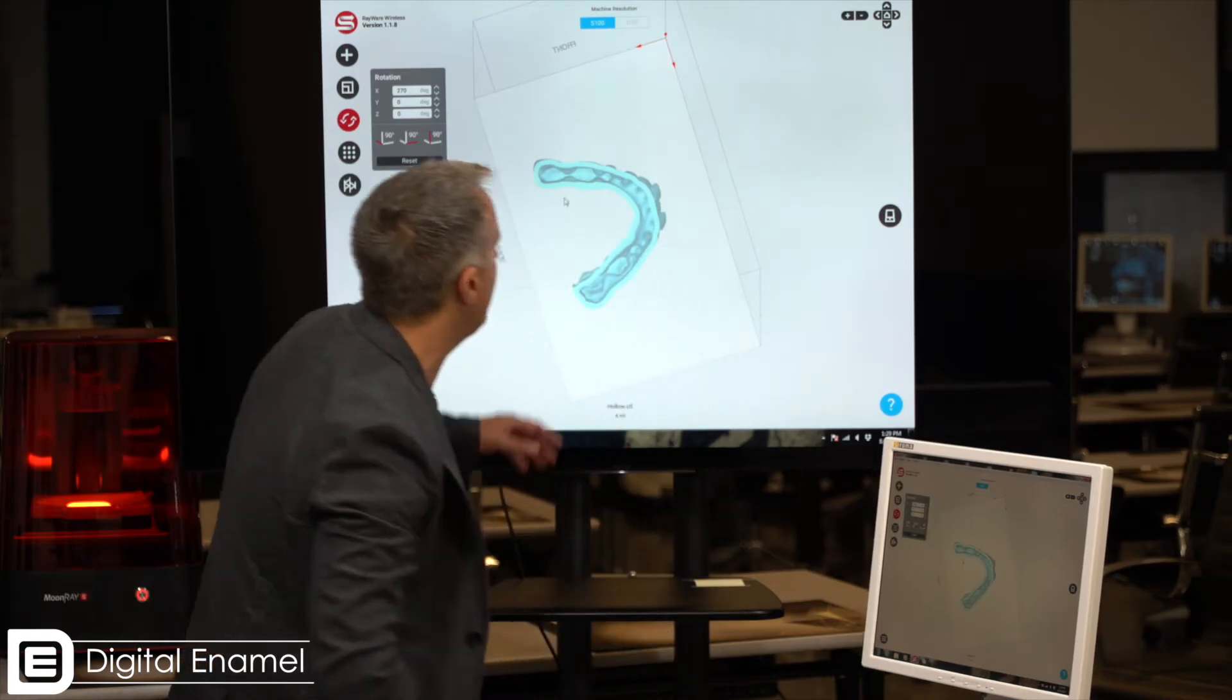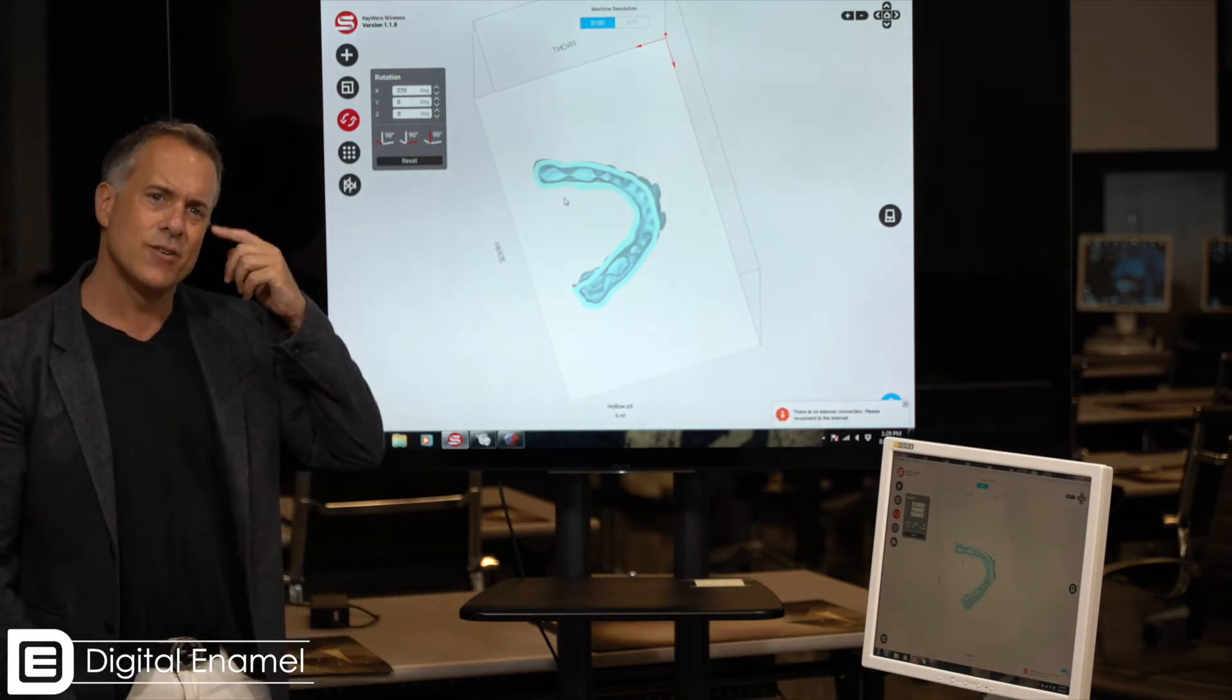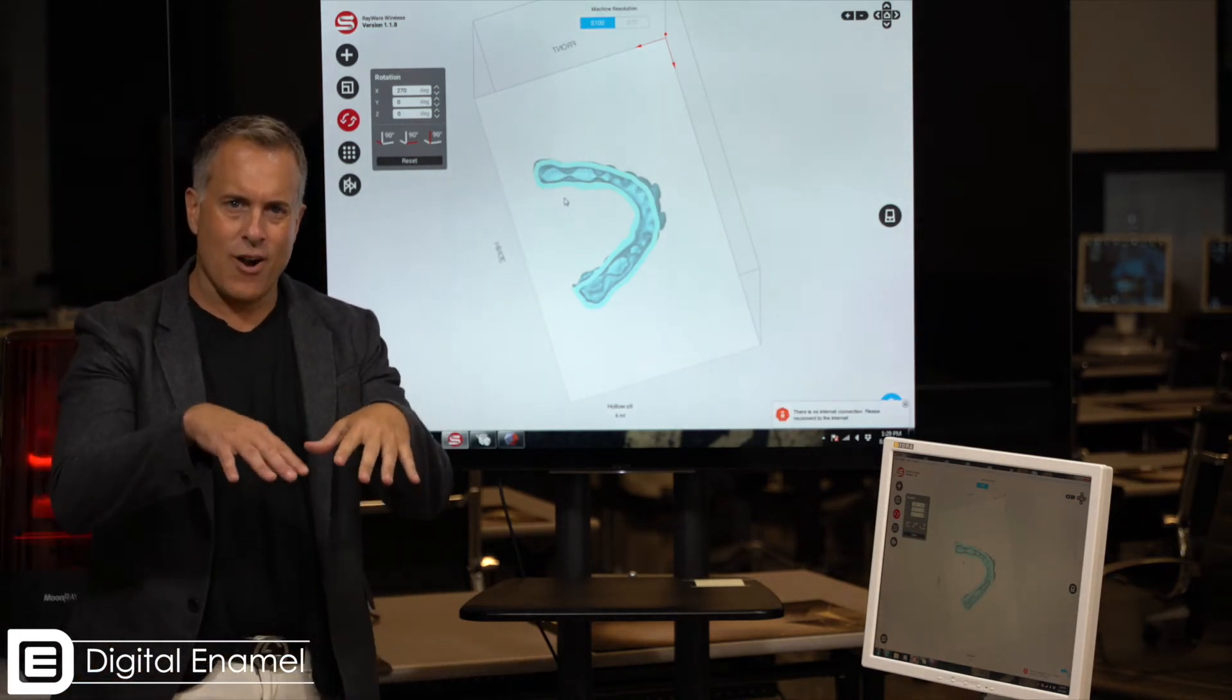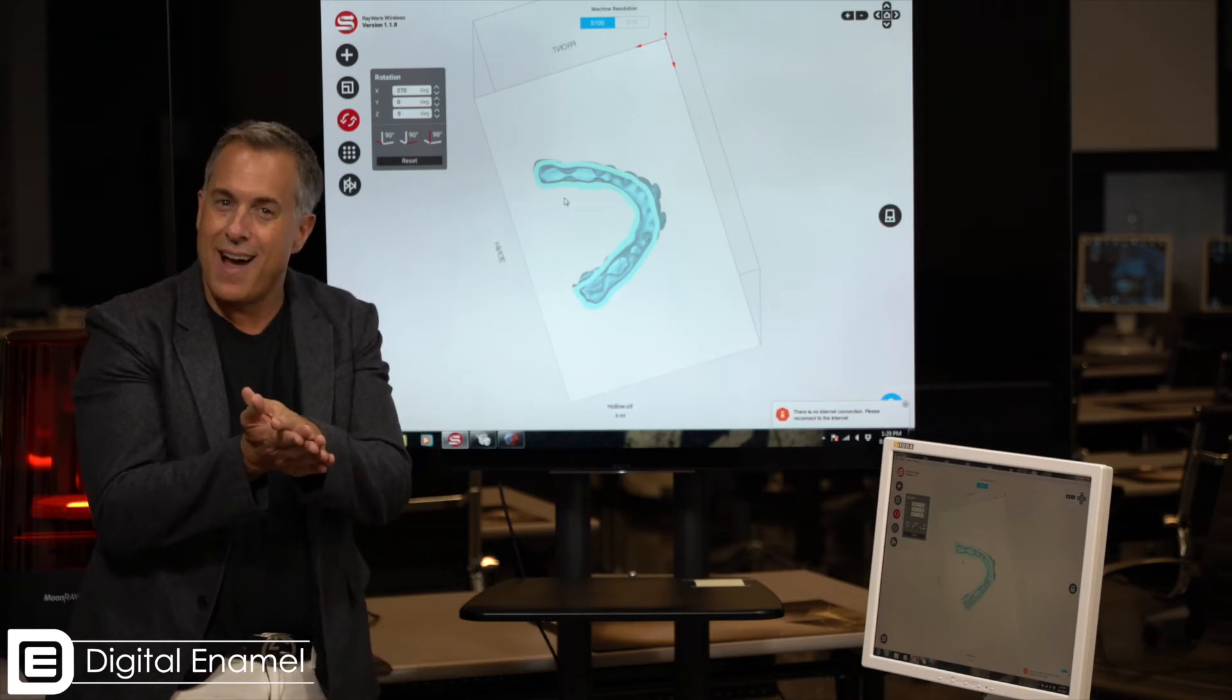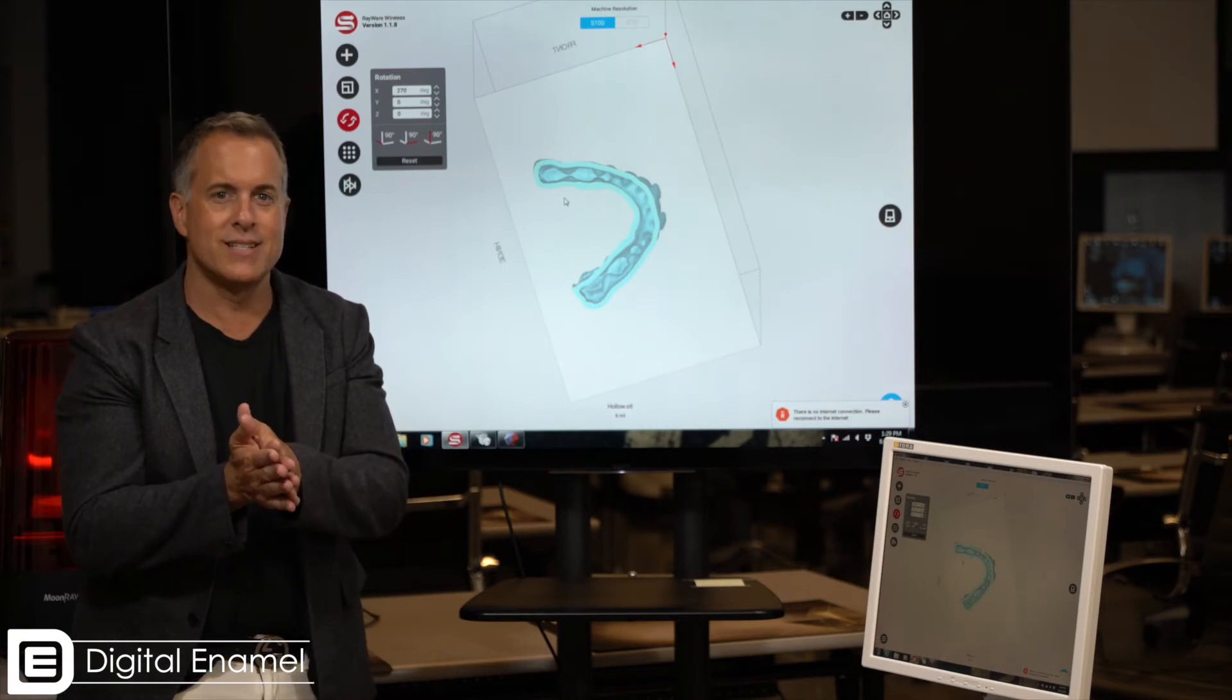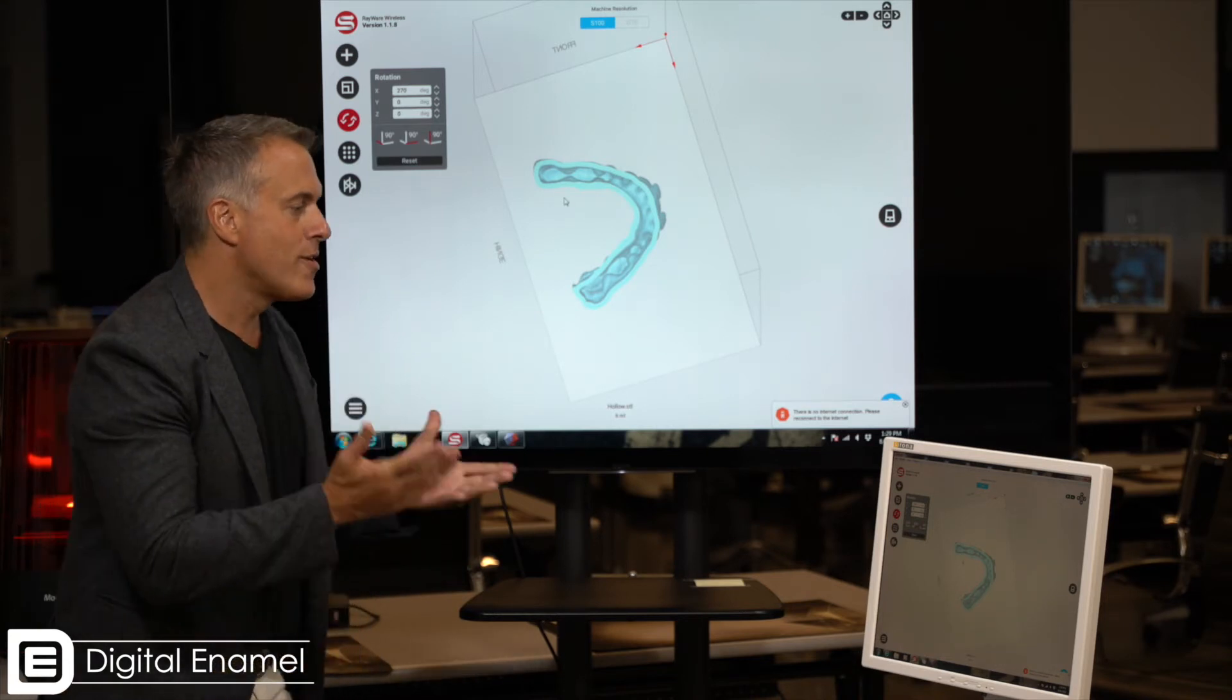Now you may notice that our model is here and it's flat on the base and you may think to yourself, well hang on a minute, we're printing on this build plate and if I print flat is that going to not make it hollow, is that going to trap some resin inside it? It won't, don't worry about it.